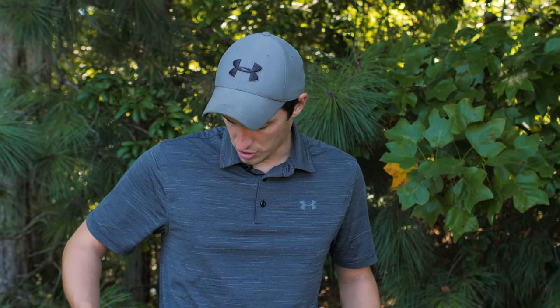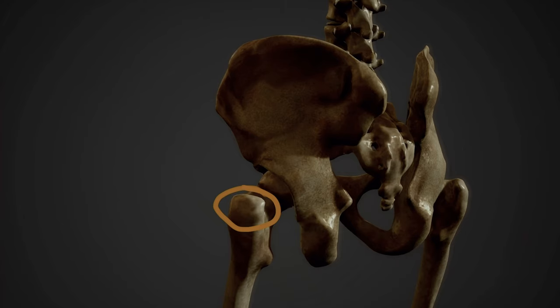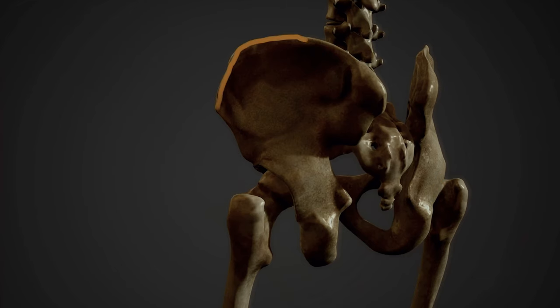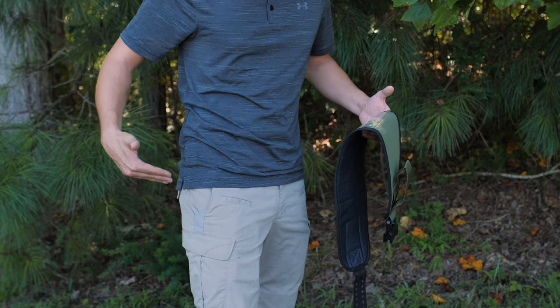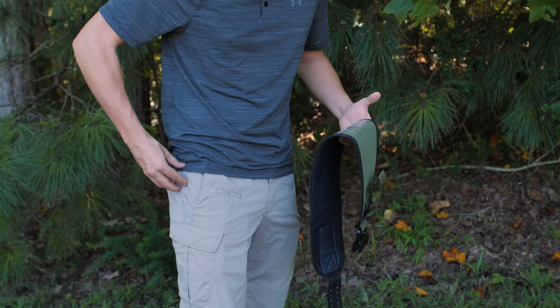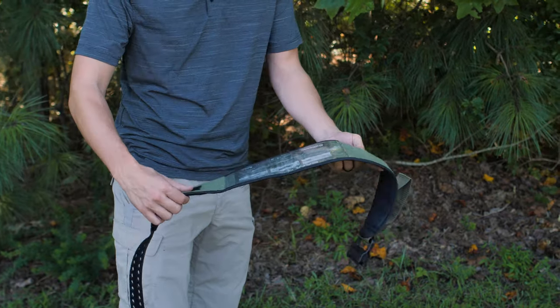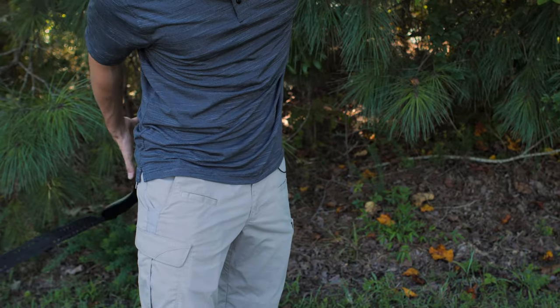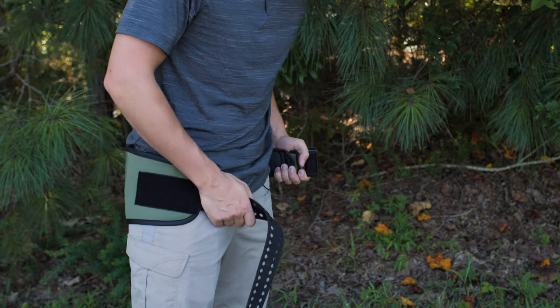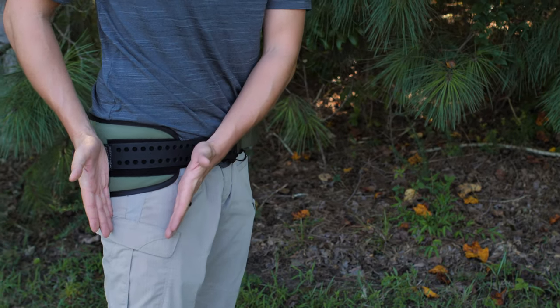Let's talk about the anatomical landmarks we're looking for. The greater trochanter is going to be the top of the femur — pretty low down. The hip bone is much higher, and we don't want to put pressure there. We want pressure on the outside of the femur, the greater trochanter — there's a bony prominence below belt level, and that's where we center the sling. We'll put it on the patient, center it up, and tighten it down right at the point of that greater trochanter.